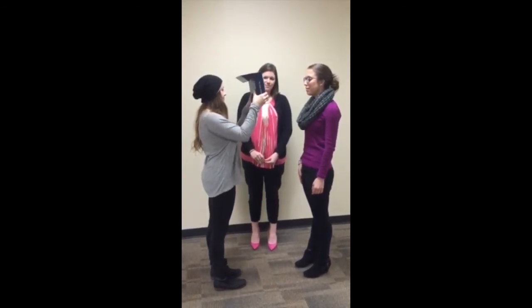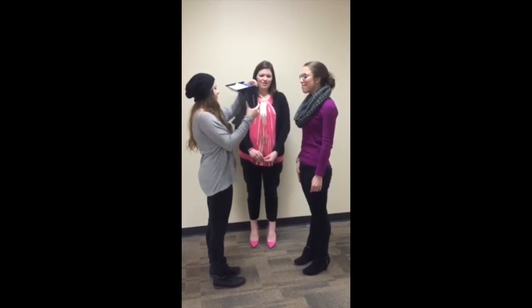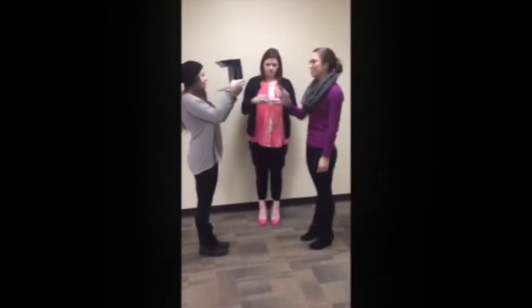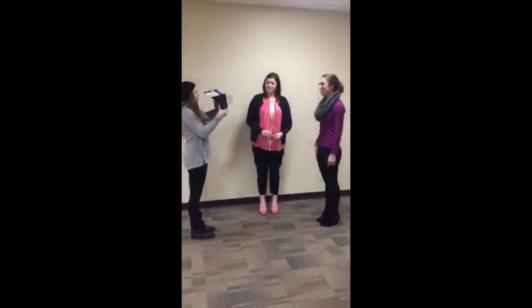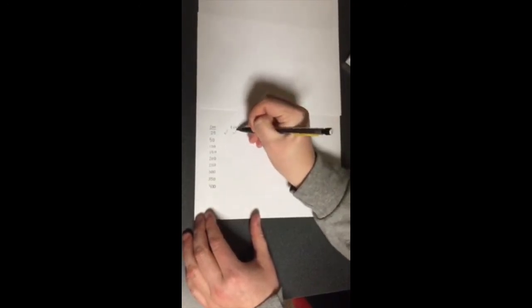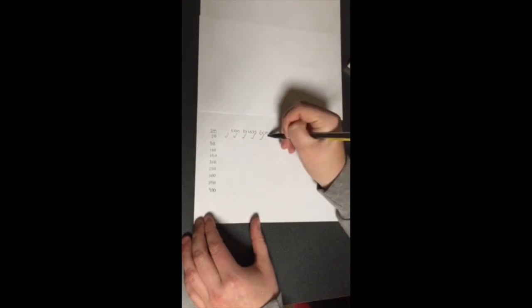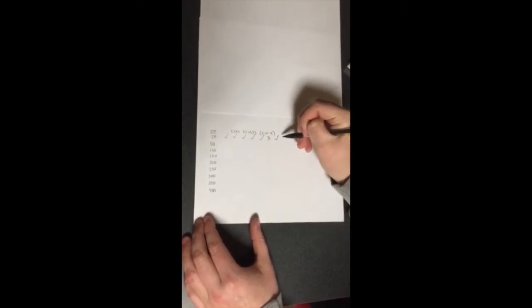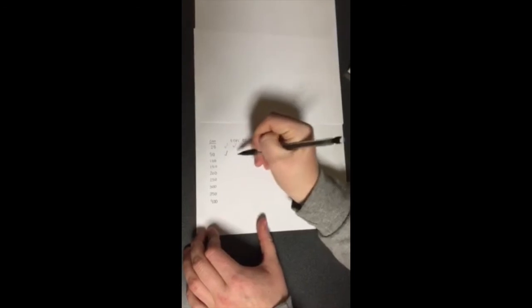We're going to continue to do this for 10 trials at each of the test distances, from 25 centimeters to 400 centimeters. While doing the trials, we will mark correct, correct, correct, and we will give them an X if they miss it, for each of the 10 trials at each test distance. We'll do that for all test distances, 25 to 400 centimeters, and 10 times for each. We will mark the percent correct for each trial.